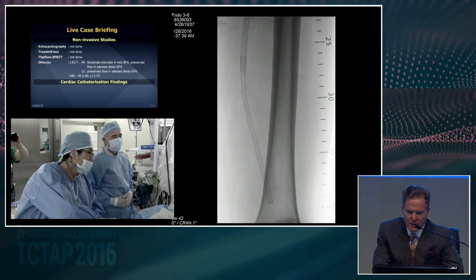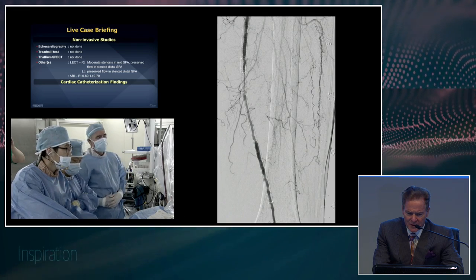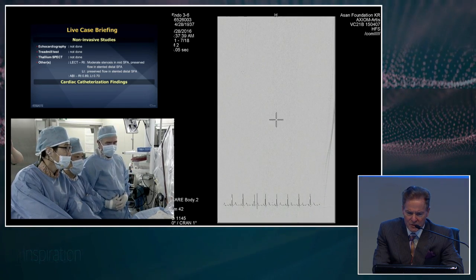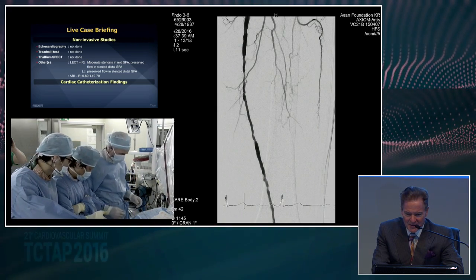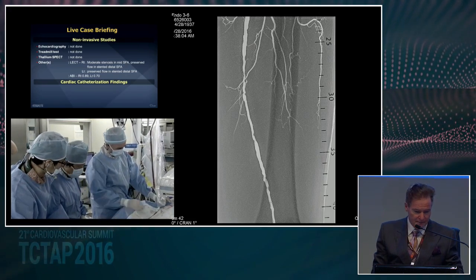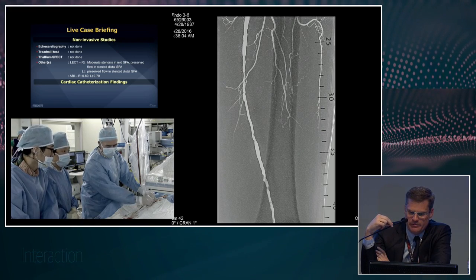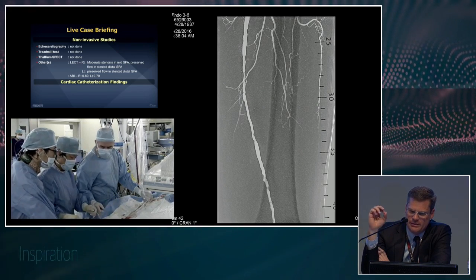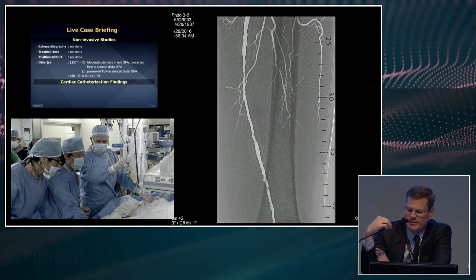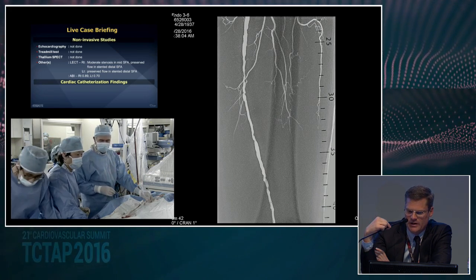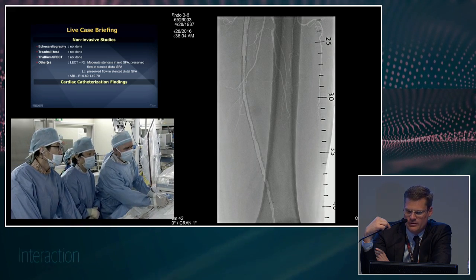I would prep the vessel before biologic therapy. We're going to have to use some sort of biologic therapy, whether it be a drug-coated balloon or drug-eluting stent. I'd use laser atherectomy — the new 2.3-millimeter Turbo-Power laser catheter, though it typically requires a 7-French sheath. Since we have a 6-French in, I'd probably use a 2.0 laser. Without laser, I'd use a scoring balloon, whether it be a Cutter, Angiosculpt, or Vascular Track to prep the vessel.